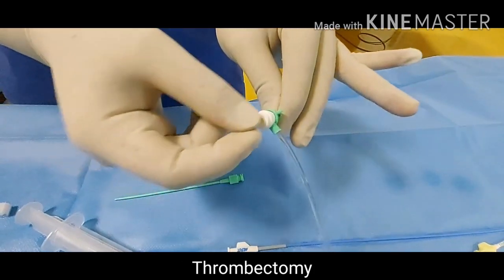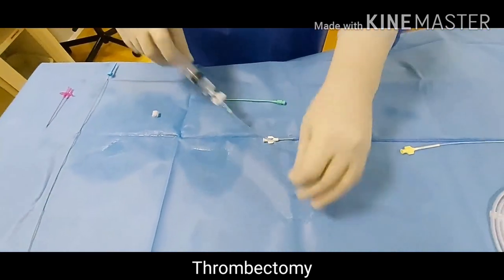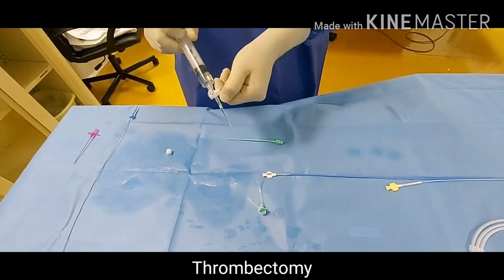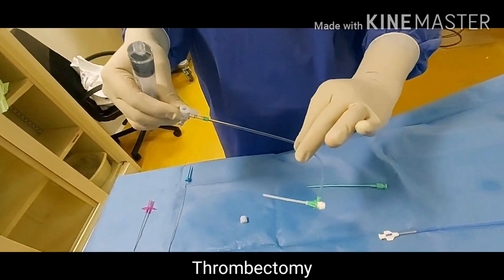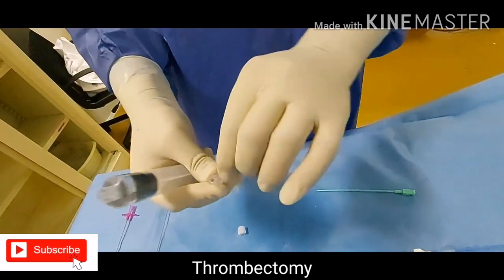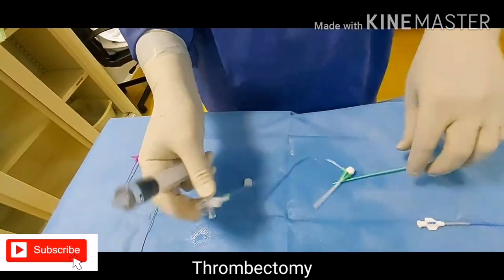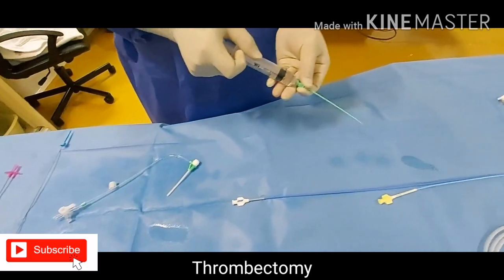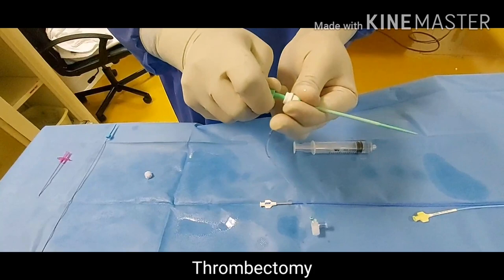After this, close the sheath and check the valve — sometimes the valve will be damaged, there will be a manufacturing defect. If you use a damaged one, there will be blood oozing when it is inside the body of the patient. Once it is sealed, lock it — the arrow should be towards the tube, not towards the side port. If you put it the wrong way the blood will go out, so always close it.